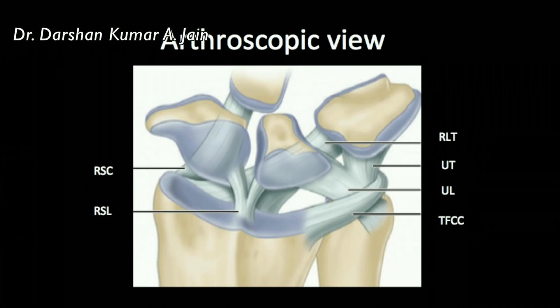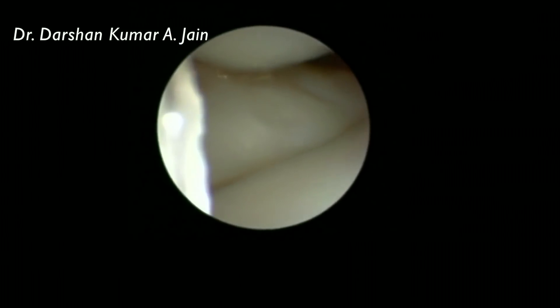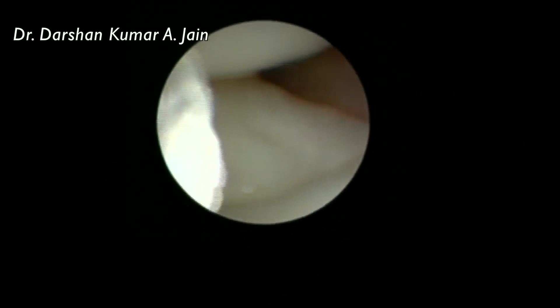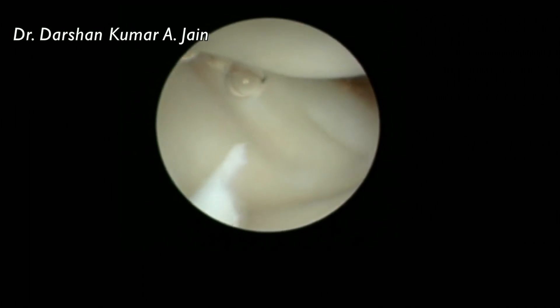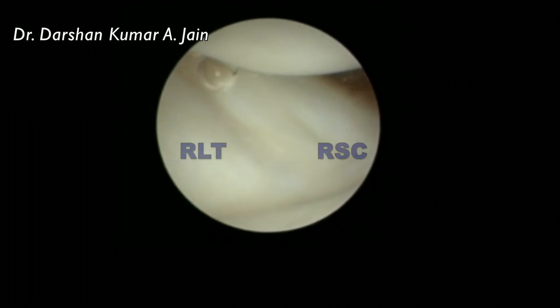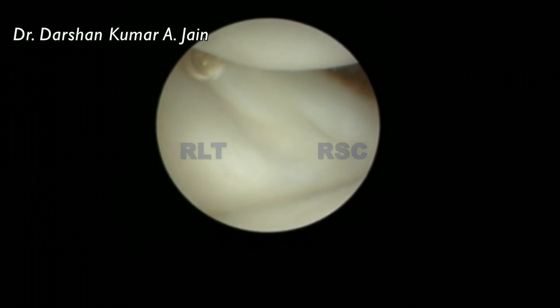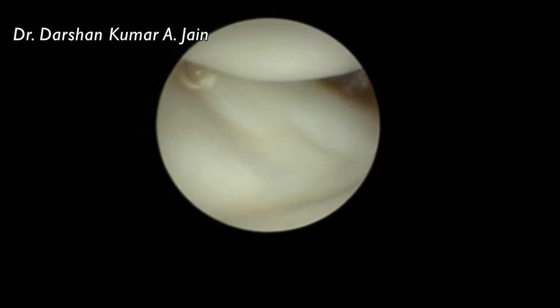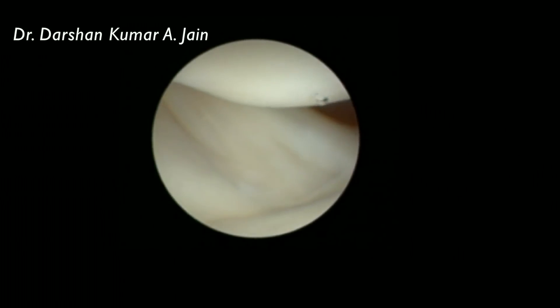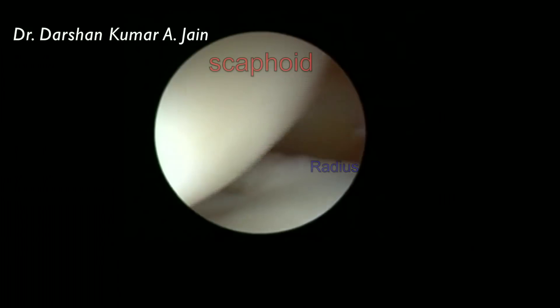The radioscaphocapitate and the radiolunate-triquetral ligaments are the two stout ligaments along the radial side, and the other ligament is the radioscapholunate ligament. You follow a set sequence of inspection. This is towards the radial side — the RSC and the RLT ligament on the radial side. As we go further radially, you can see the radial styloid as well as the scaphoid.